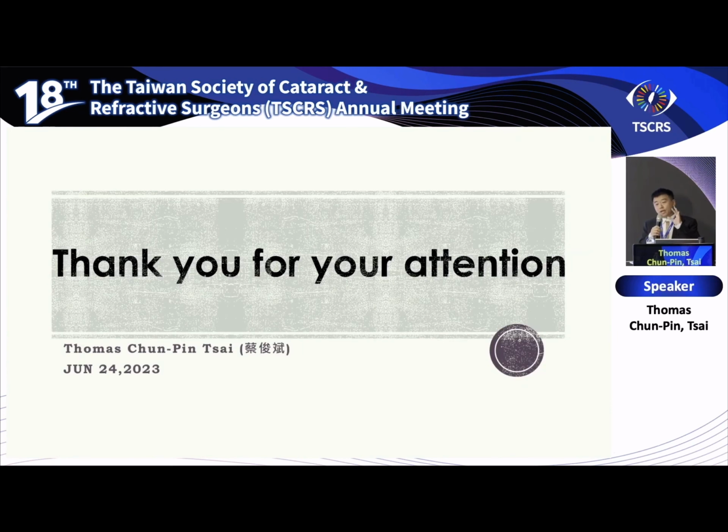If their old glasses have astigmatism correction, that means this patient may benefit from a toric IOL. If we give correction, the patient will not say, "Oh, I feel it's worse." If it feels worse, then maybe it's not good for a toric IOL. And I think the topography is most important.